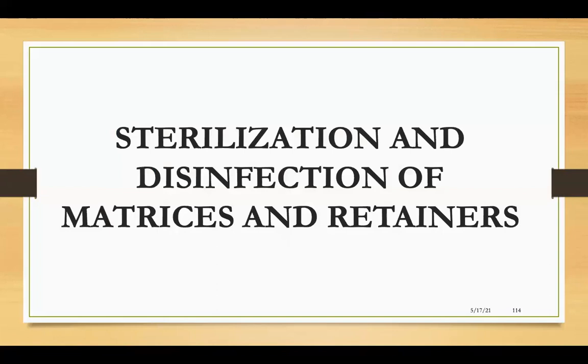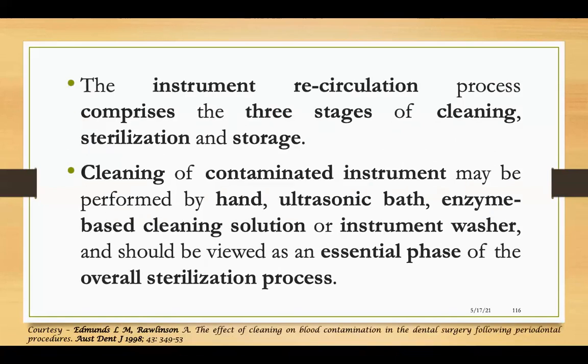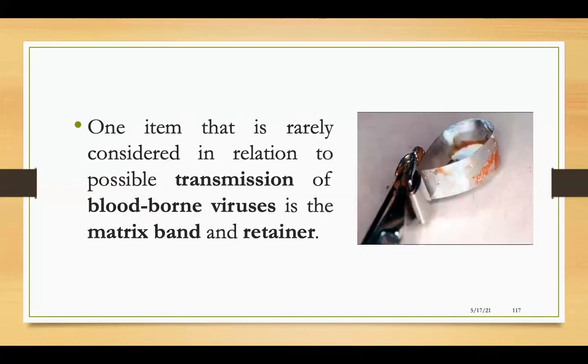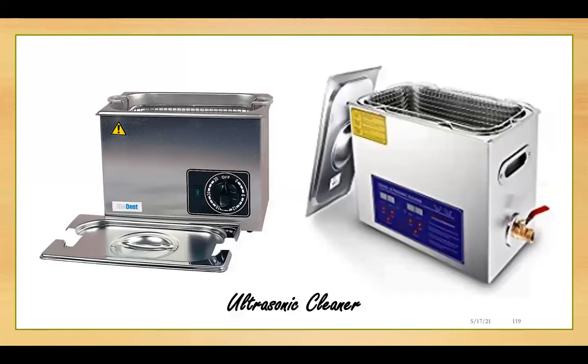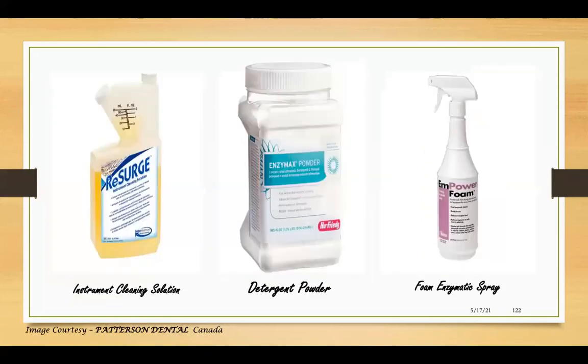Sterilization, this is like a PG level lecture that I created back in my day, so not very important. All you need to know is that it does get contaminated with blood and saliva. So you absolutely need to get rid of your bands. You have to throw away the bands, and the other device you can clean under ultrasonic cleaners. Ultrasonic cleaning solutions are available, enzyme tablets, dual enzymatic detergents that you can use to clean the device, not the band.